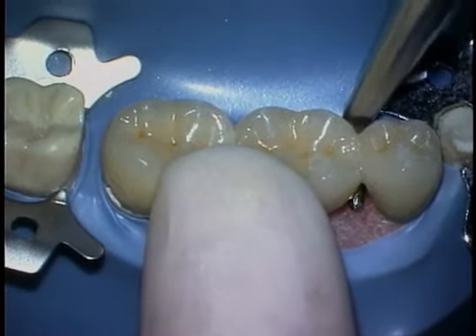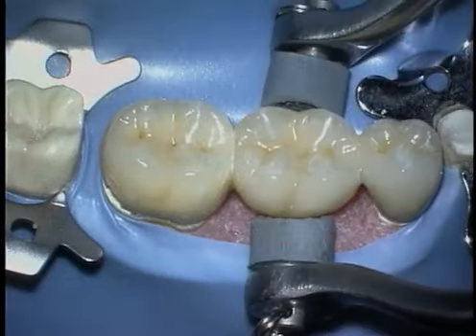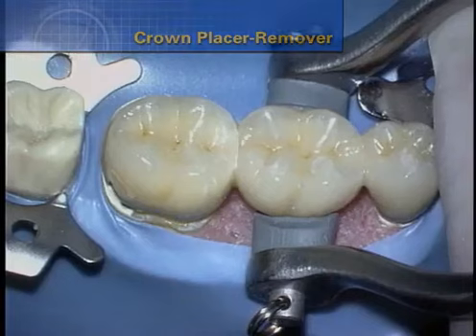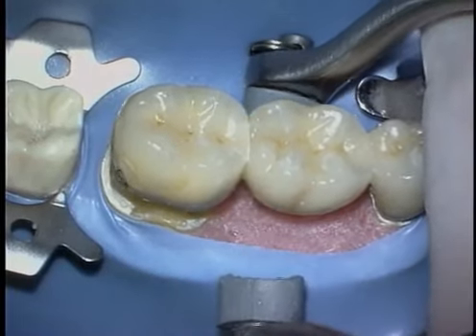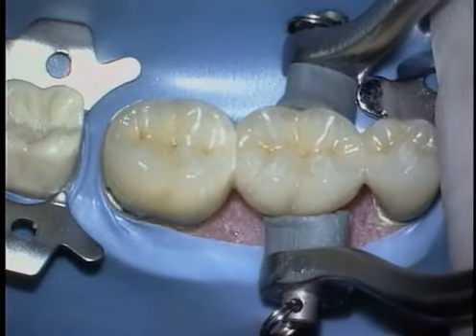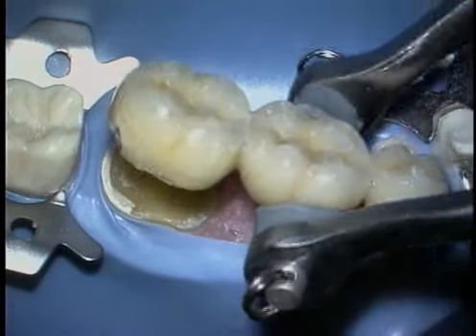Now that the bridge is loosened, the crown placer remover with rotating grippers is selected to cushion and protect the bridge. The grippers are best positioned below the buccal and lingual heights of contour to facilitate retention during the removal process.